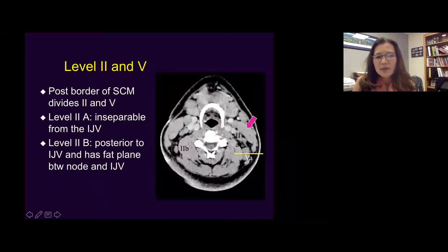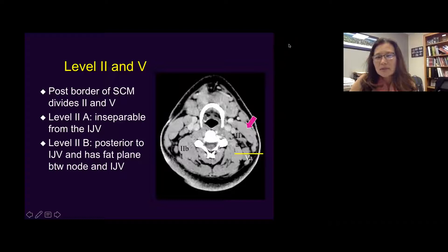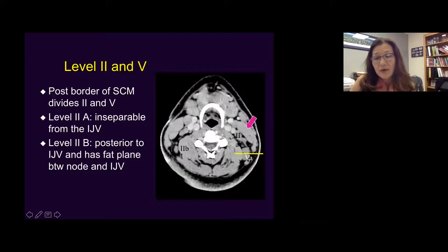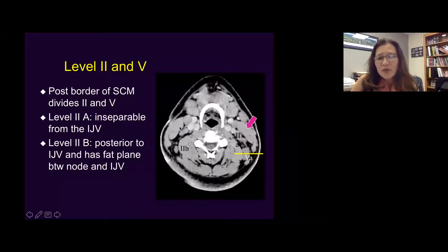Level two and five are divided by the posterior border of the SCM. The posterior border of the SCM really divides zones two and five. For example, a lymph node posterior to the posterior border of the sternocleidomastoid muscle would be classified as five, and if it's also higher than the cricoid, it would be level 5A. Any lymph node medial to the sternocleidomastoid would be level two. Lymph nodes very close to the jugular vein with no fat separation would be 2A, and something more posteriorly but still medial to the SCM would be 2B lymph nodes.